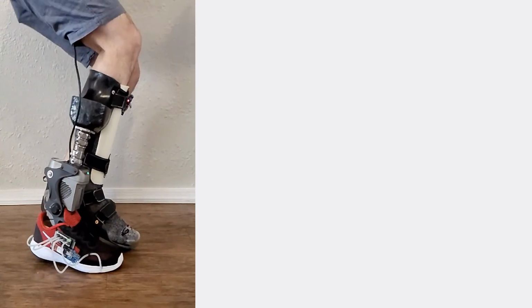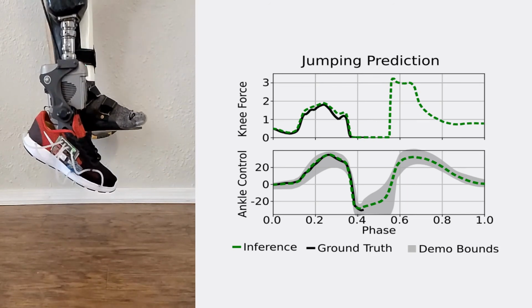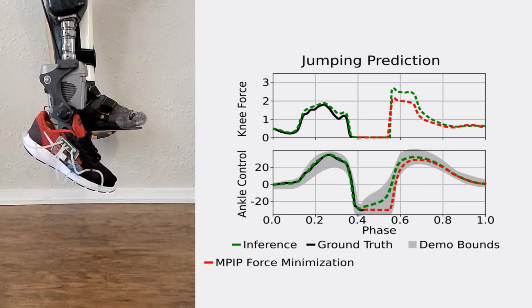Due to the nature of the jump, it is impossible for our interaction primitive model to accurately differentiate between the two modalities, soft and hard landing, since both exist as equally likely possibilities. We should therefore expect the probabilistic model to perform some average control trajectory. However, due to ergonomic considerations and the long-term health benefits from reducing joint impacts, it would be beneficial to select the type of impact desired. Our model predictive control extension does just that, and shows successful optimization of the ankle angle control to either reduce the impact force on the knee joint or to increase it.